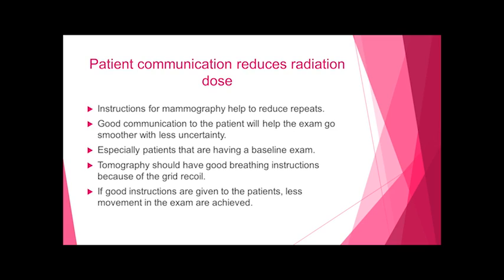The patients aren't listening. They hear you, but they aren't listening because they're nervous and they're not paying attention to the technologist. So you have to train your technologists on good communication skills. Tell them not to use words like left or right. Tell the patient, step towards me, step away from me, lean forward, step backwards instead of left and right. There are different types of communication skills that technologists should learn. But you definitely can reduce the dose with good communication. Therefore, you don't have to repeat. So it does reduce the dose.